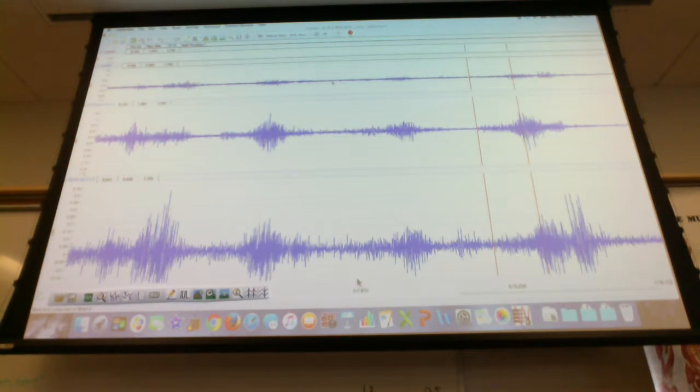But for those of you who have done all the flexion stuff, I want you to go down to the extension, find one extension that really works well, right? That's the easiest to see. And then measure the magnitude of the EMG for the anterior and posterior for that one good extension. Because that really, I don't know why it's so clear.